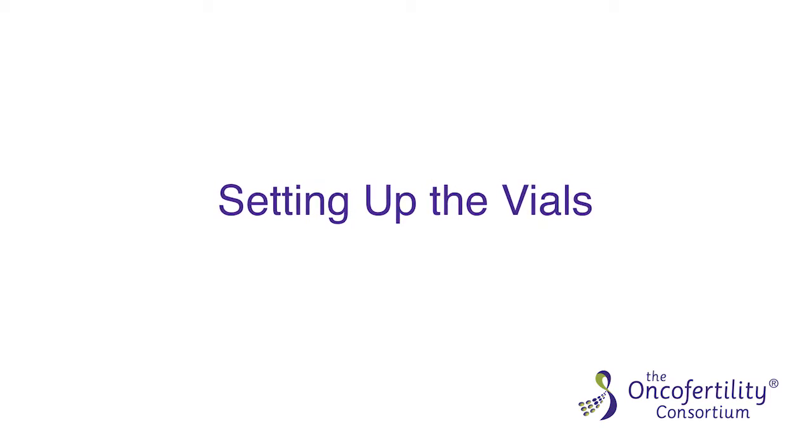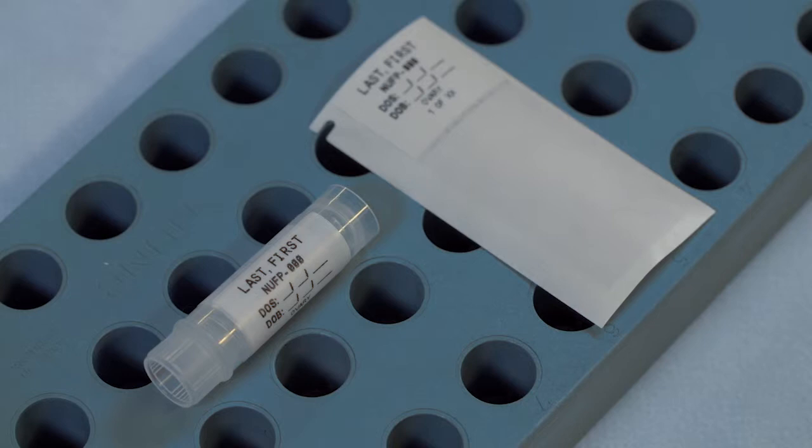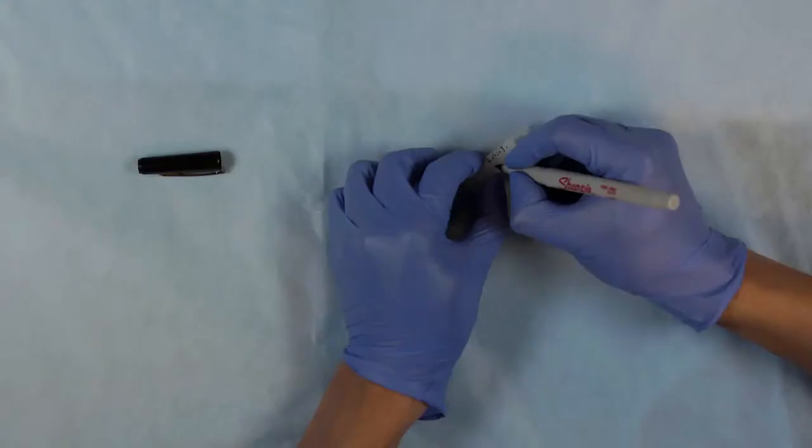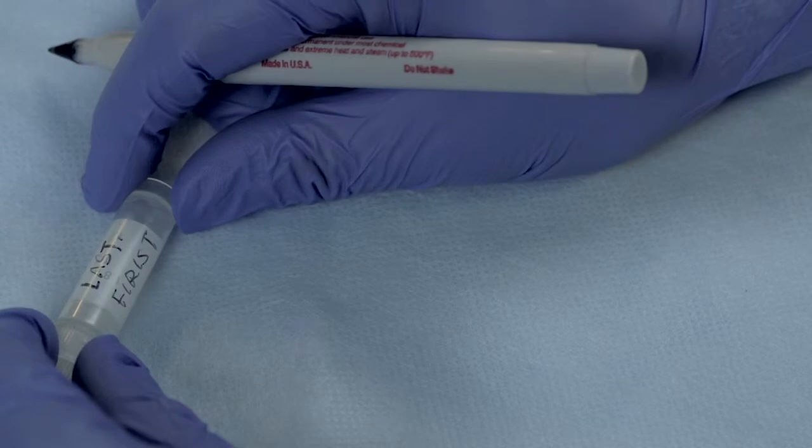Setting up the vials is the first step. It is recommended that you use a mechanical labeler because of the amount of information that needs to be on each label. Please refer to the labeling protocol in the online NPC manual. We also recommend that you label each vial with the patient's name by hand, just in case the labels were to come loose.